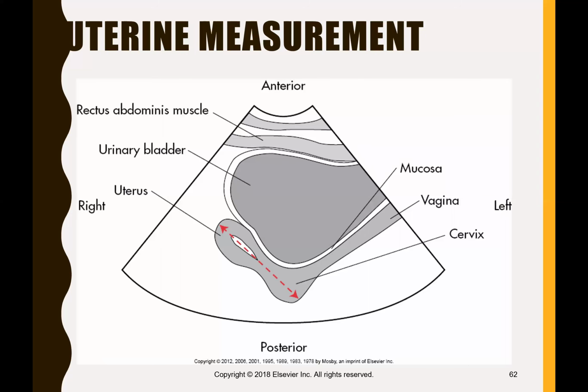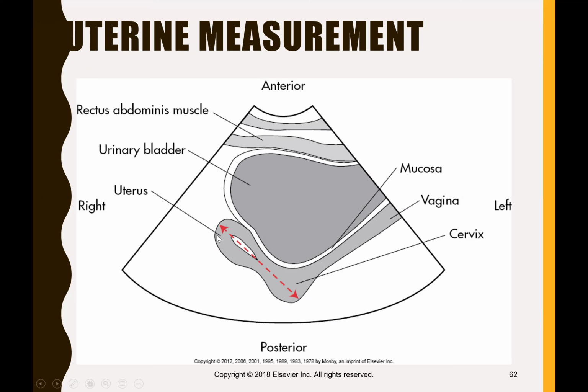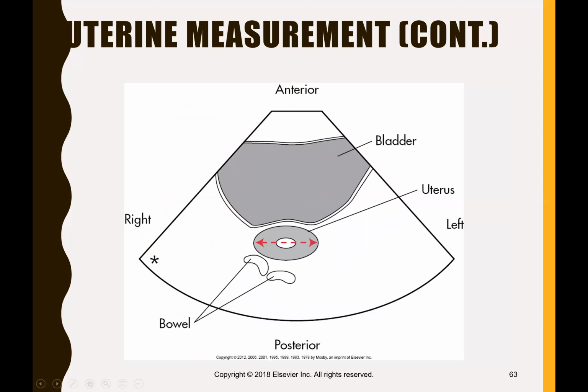We're going over the uterine measurements one more time. So from the fundus to the cervix, this long area, you remember that the vagina is like 9 centimeters long. It goes like a tube, and then the cervix is going to be the first part that you measure, and then the fundus is going to be the tip there, and that's going to be your sagittal length. This is the transverse image, which you'll just turn the probe in transverse to get that image.